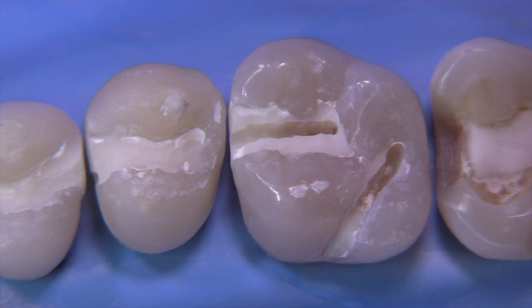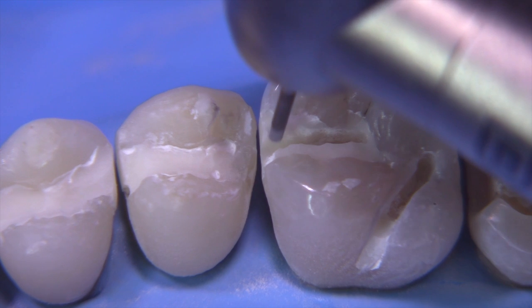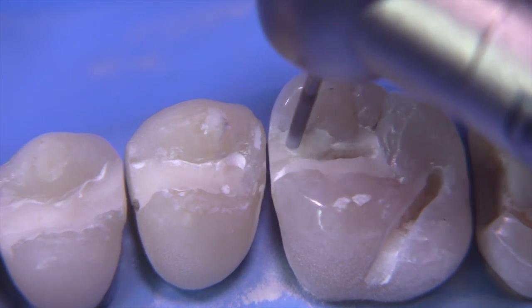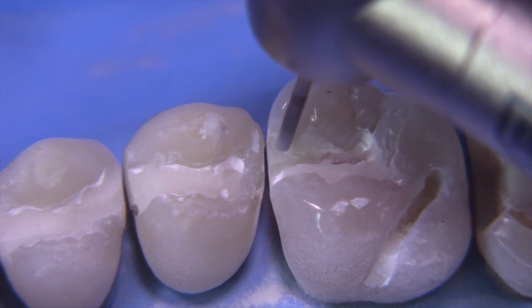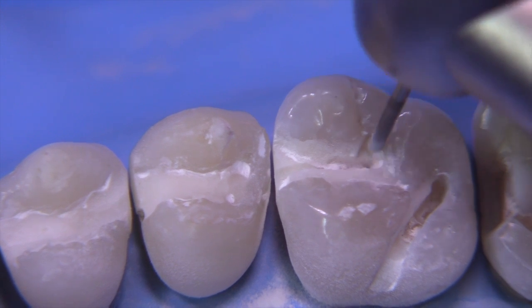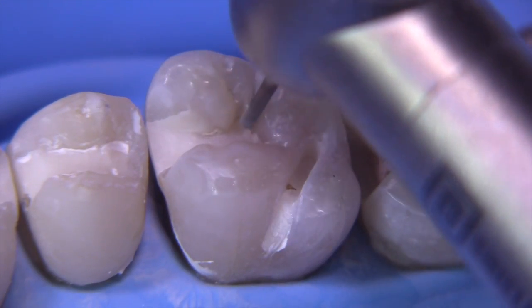With the little slits placed, we now have a nice reference as to the ideal depth, and we can switch over to starting the inlay. I'm going to use a 55 today — you could use a 56 or even a 57 — but this is a pretty small inlay. Clearly this is a case that could easily have been treated with direct composite; we chose to do this quadrant in gold to demonstrate the various techniques. We start by getting the proper taper on the facial, keeping the depth even with the depth cut already placed.